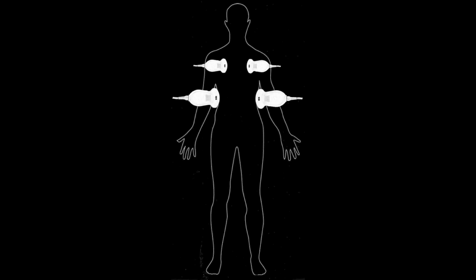Which zone you use really depends on what you're looking for. If you think about it, when you put stuff in the pleura, whether it be blood or air, it's going to follow the rules that gravity dictates for it, right? If you put air in the thorax, it's going to rise to the top because air is a non-gravity dependent thing. And so we'll look in the anterior lung zones when the patient's lying supine, right? If you put blood in the thorax, it's a gravity dependent thing. It's going to fall to the bottom. And so we'll want to look in the posterior zones as this patient's lying supine in the bed right in front of us. What we're looking for determines where we're going to go.